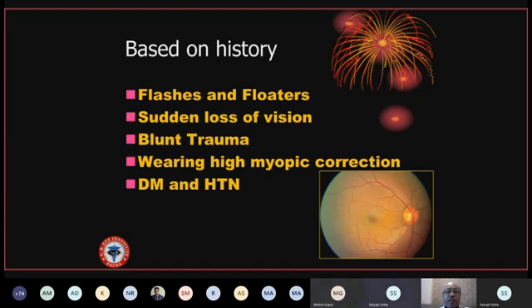So Pooja, you have to answer this question. When you are doing indirect ophthalmoscopy, how to look for snow banking and snowballs is the question. And Dr. Atul's question is slit lamp biomicroscopy regarding slit size and angulation in matrix. Dr. Atul, I will leave your question for now. I'm sorry for that. We'll stick to indirect ophthalmoscopy right now, but Pooja, you will have to answer the question later on.